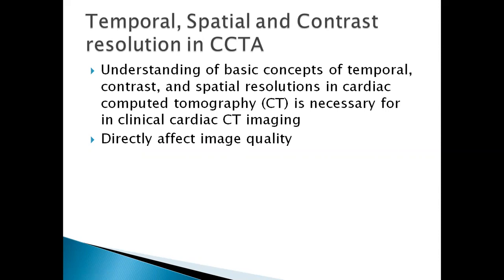Image quality is one of the most important things when you're doing this examination. So we're going to look at just a little bit about contrast, temporal, and spatial resolution, just to see how you can maximize and make sure that you get an optimal diagnostic image. Understanding the basic concepts of temporal, contrast, as well as spatial resolution in CT is very necessary because they affect the image quality directly.